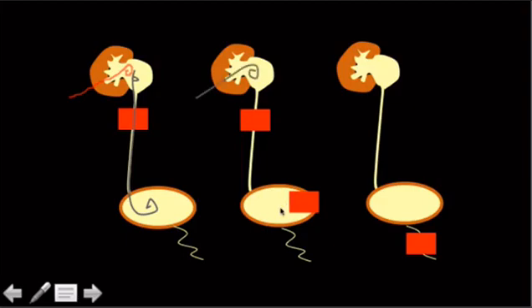So in this situation, he just needs a nephrostomy tube because he has to decompress here. Now, long-term, maybe he needs an ileal conduit or something, and then you could put one of these from here down into his ileal conduit, and that would be better for him so he doesn't have a tube hanging out of his back. But in the meantime, he's going to end up with one of these.